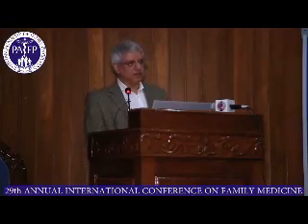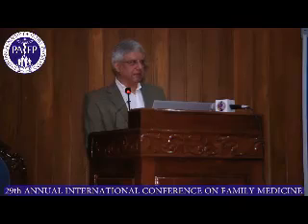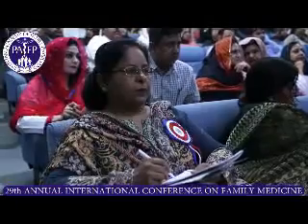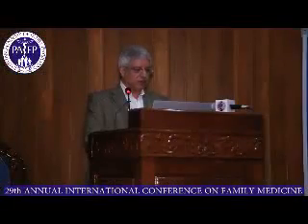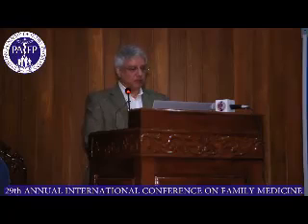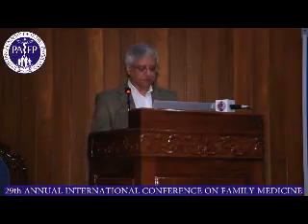For smaller lesions like pituitary adenomas, CT used to be the baseline workhorse for us, but now it's practically obsolete. Pituitary is imaged only with MRI, and that too with contrast. Without contrast, there is no point. So it can actually show the pituitary adenomas, whether they are small like this in one hemisphere of the adenohypophysis, or large like this, where it's actually compromising the optic pathways.